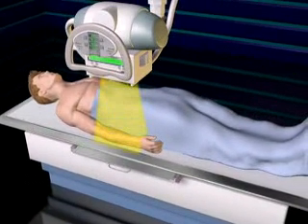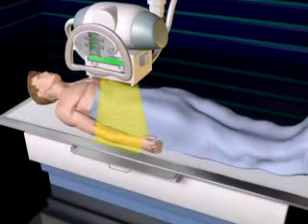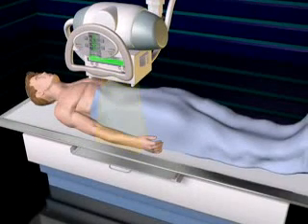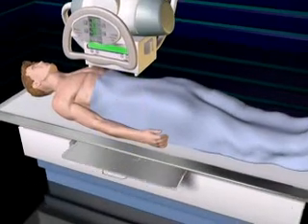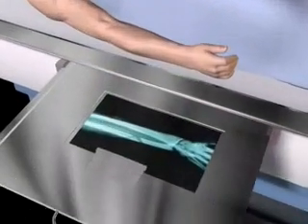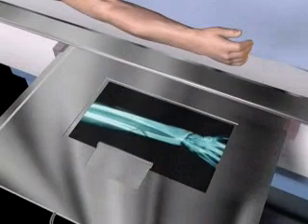Softer tissue allows more x-ray light to pass through, while harder tissues, such as bone, allow less light to pass through.